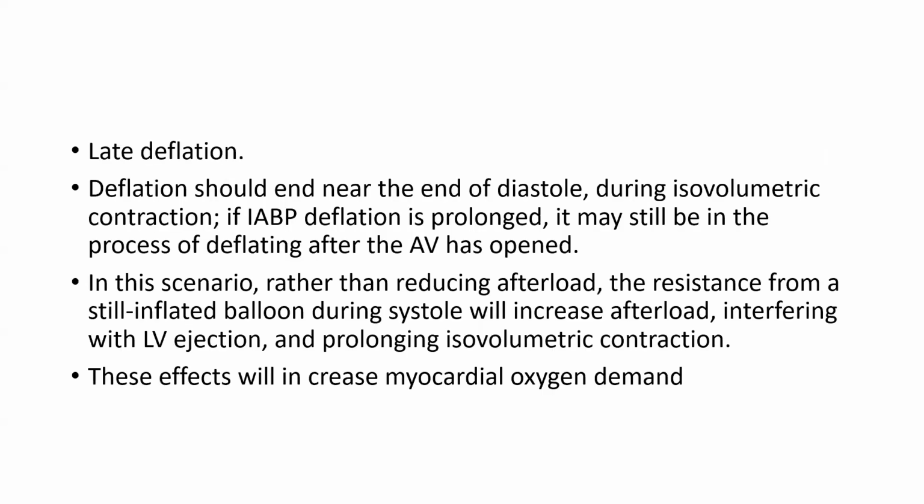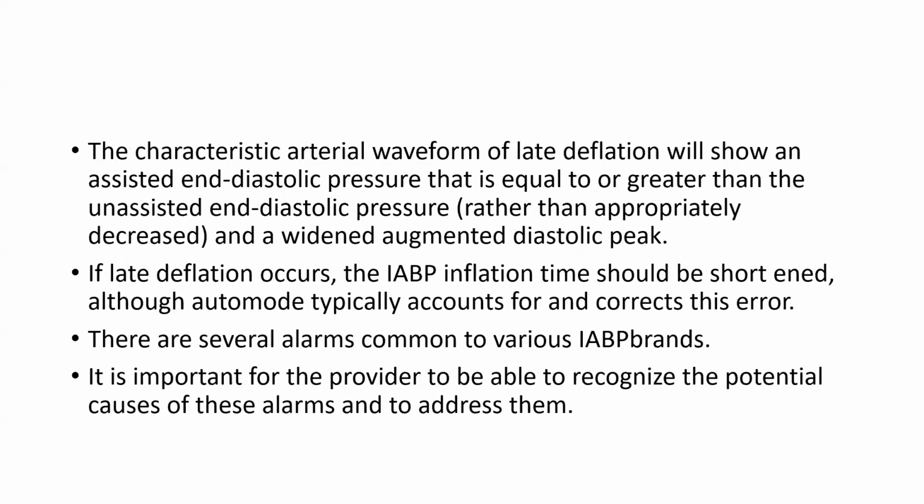Now the late deflation. Deflation should end near the end of diastole during isovolumetric contraction. If IABP deflation is prolonged, it may still be in the process of deflating after the AV has opened. In this scenario, rather than reducing afterload, the resistance from the still-inflated balloon during systole will increase the afterload, interfering with LV ejection and prolonging the isovolumetric contraction. This effect will increase the myocardial oxygen demand.